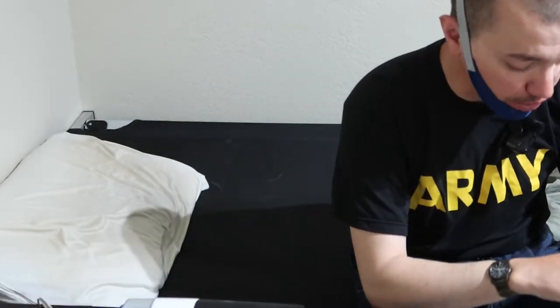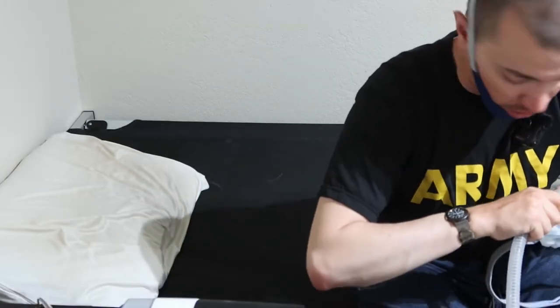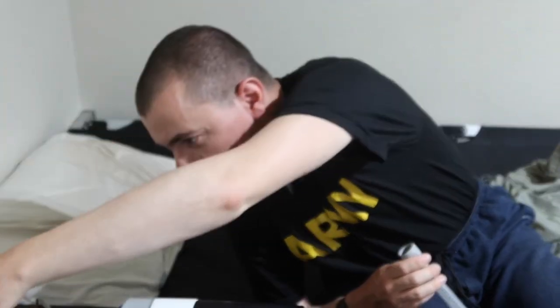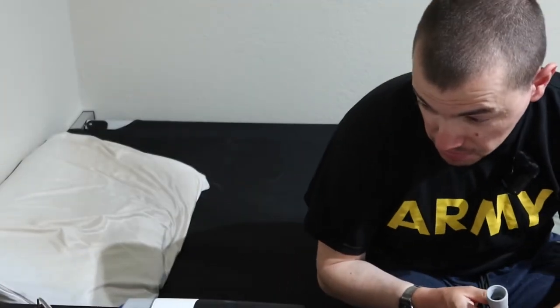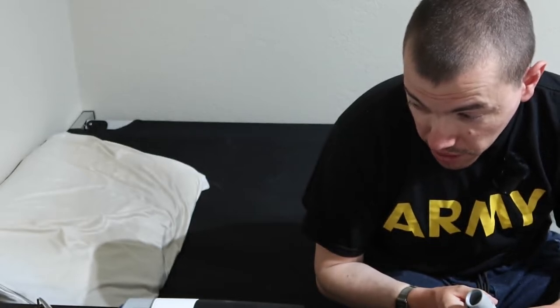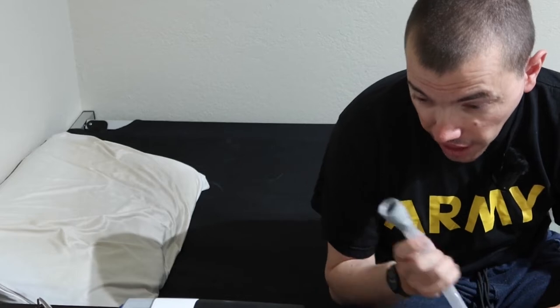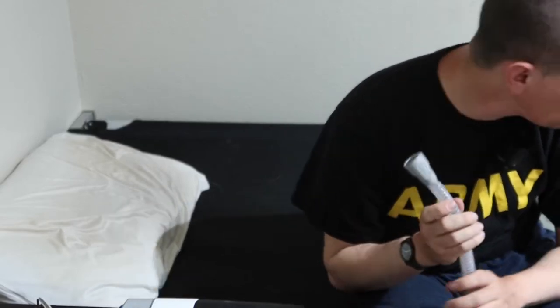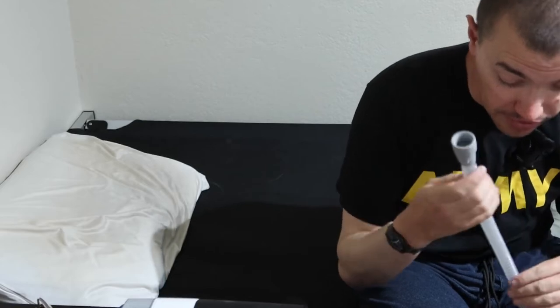I sleep underneath covers — I don't care if it's 30 below or 90 degrees above. So that cord gets in the way. But this is a legit option. The chin guard helps keep your mouth shut. I don't know how the nose mask works for people who snore, but c'est la vie.